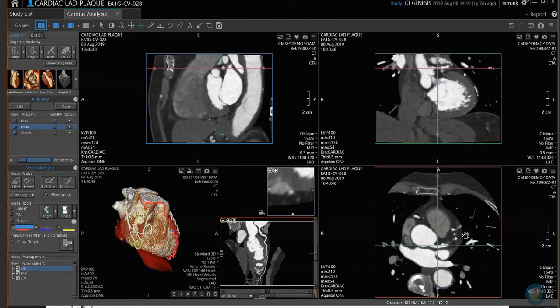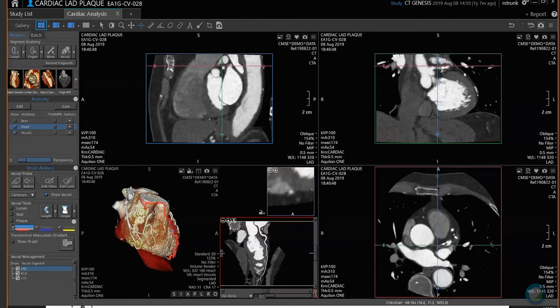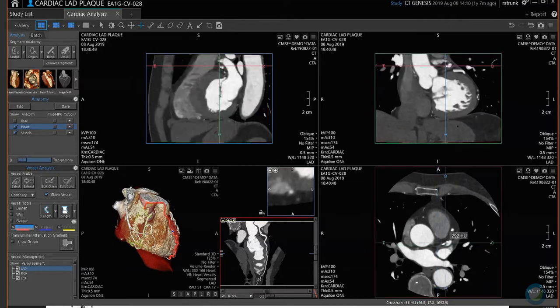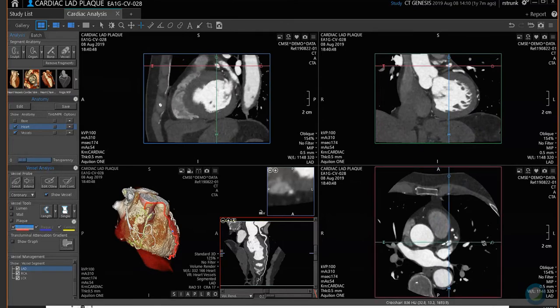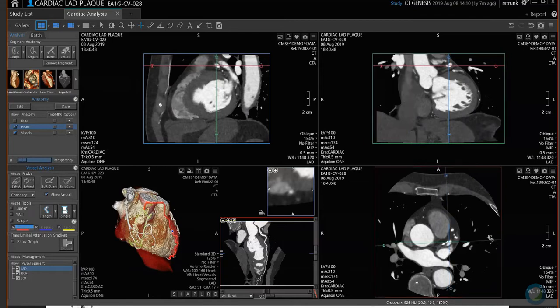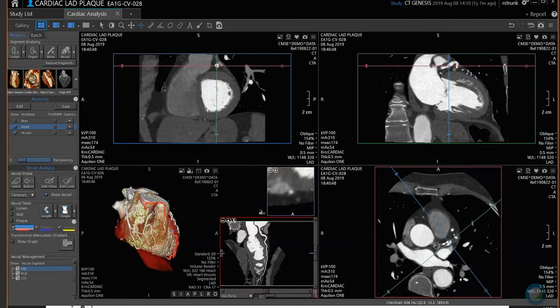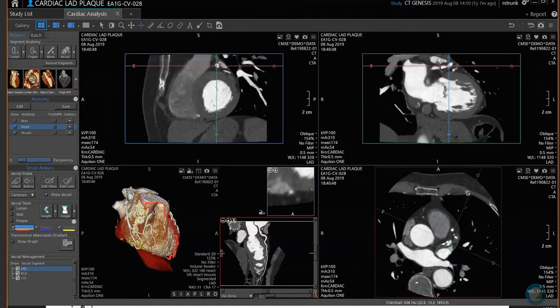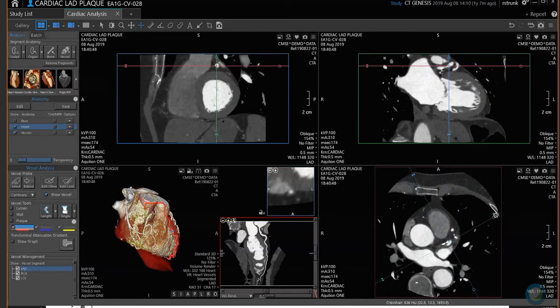If you want to line up a vessel — let's say the LAD — put your crosshair with your left mouse on the LAD, then grab where your mouse becomes a double arrow and line it up with the LAD. Since I lined it up with my green crosshair, here is the LAD in the green box.